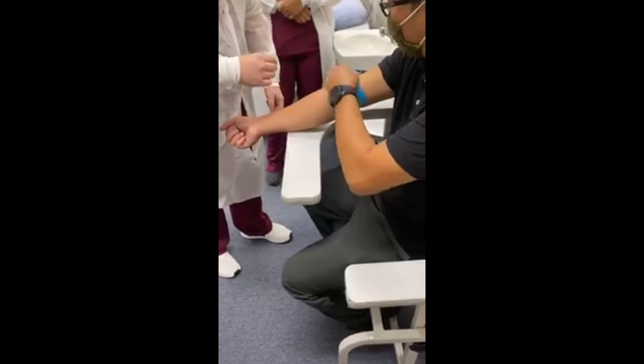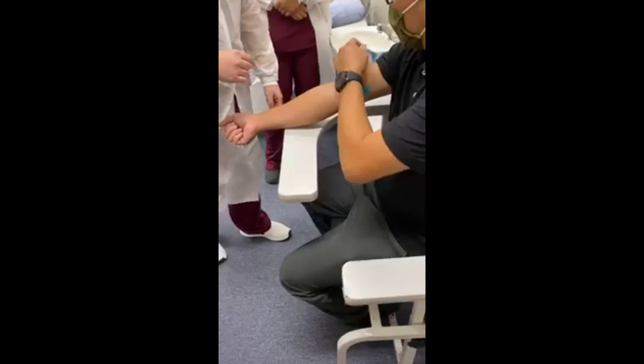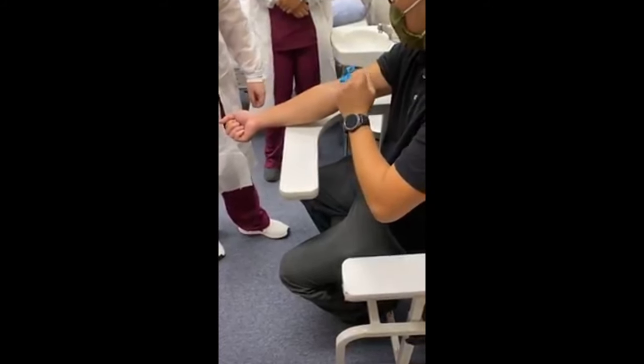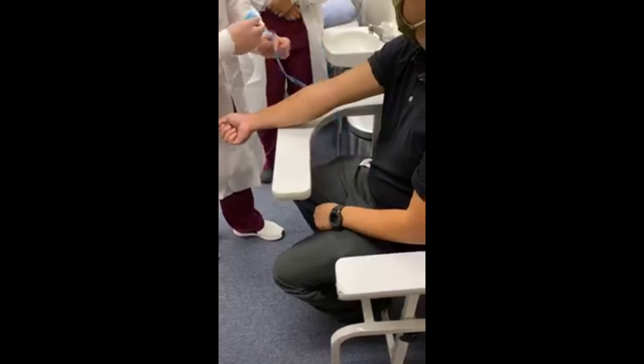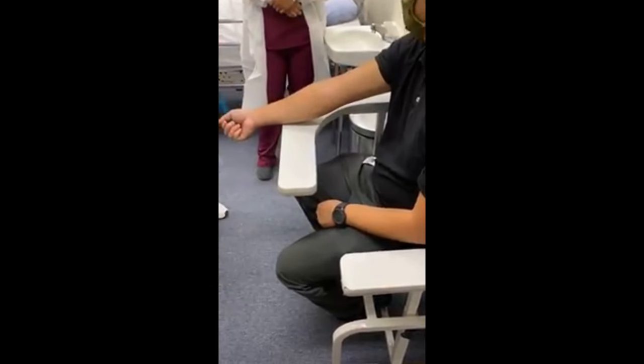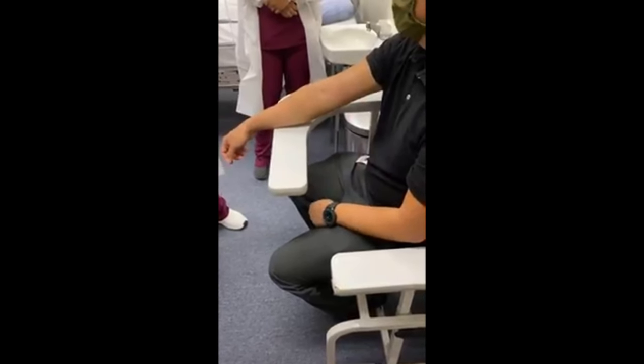And then you have this one. You prefer the smaller one here to pull. So it's always the one that you tuck under that you pull? Yes. And then that will release it. All right. Good job.